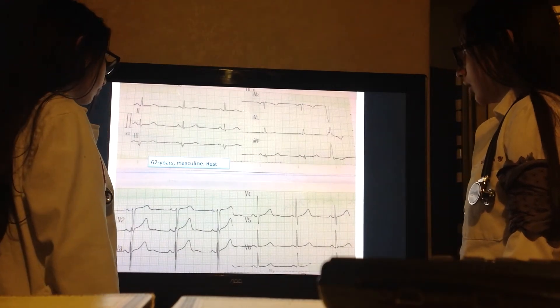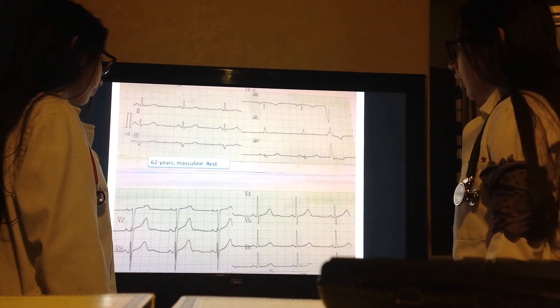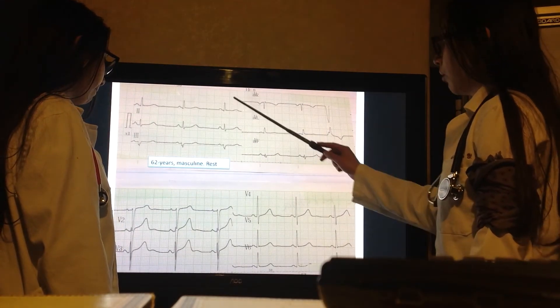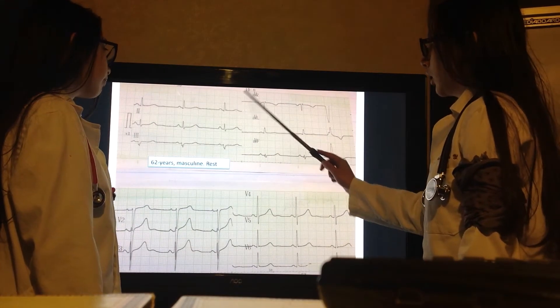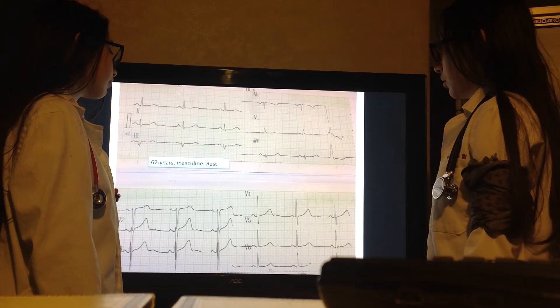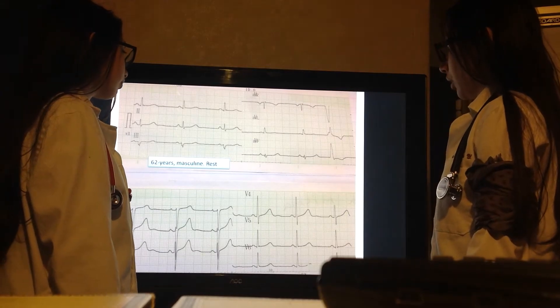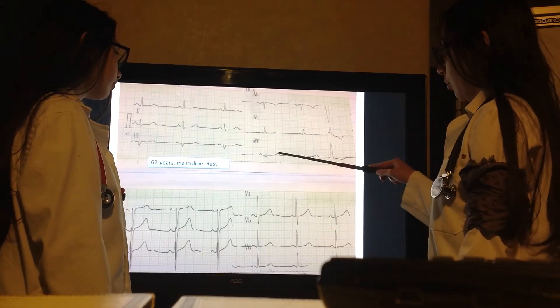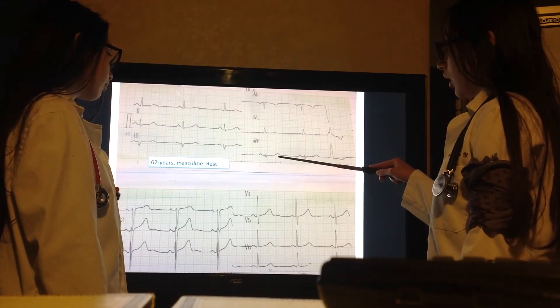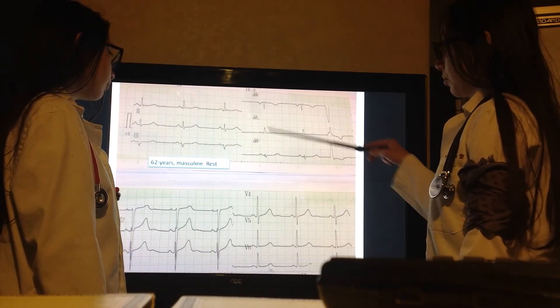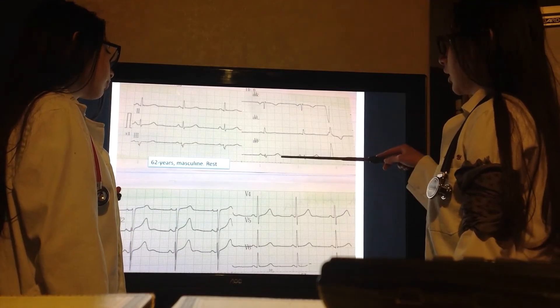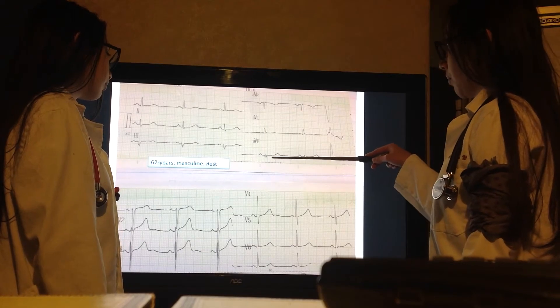The axis of the QRS is in D1, because the derivation which is most isoelectric is AVF, and D1 is 90 degrees from AVF.